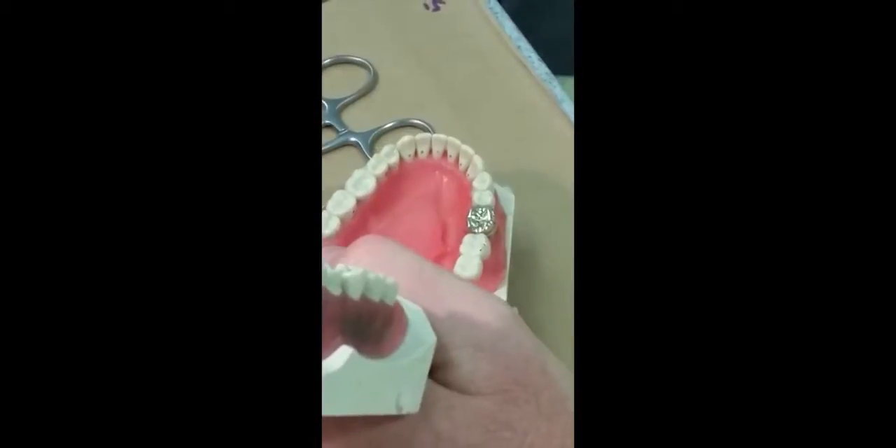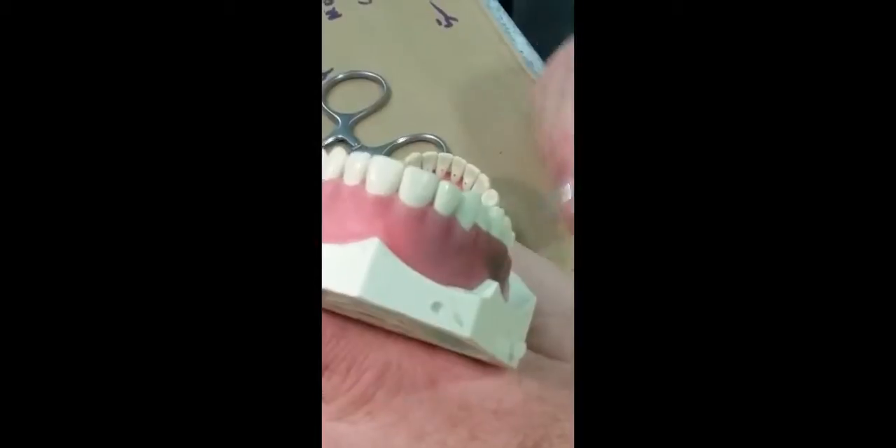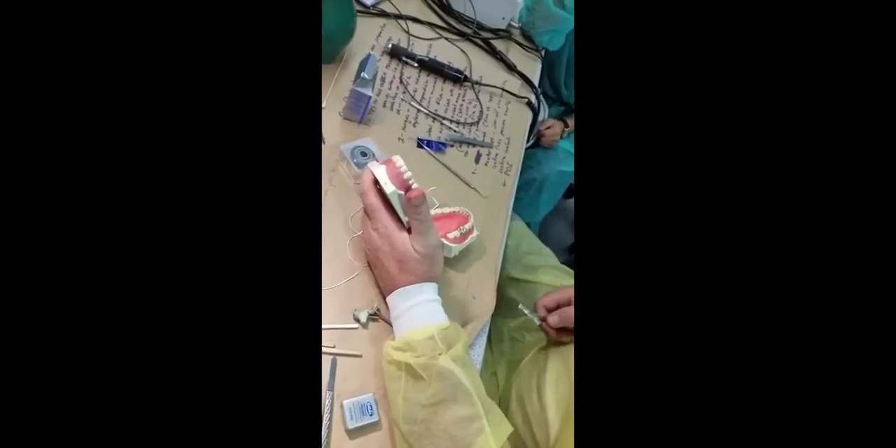You need to ensure you have a stable pattern of contacts — a tripod, a bipod — something that preferably has contact on the mesial part of the tooth. Here we've got an intercuspal position and we're satisfied with that.